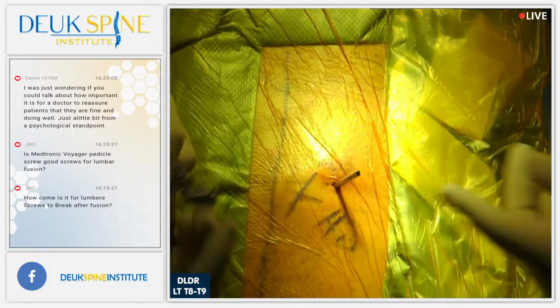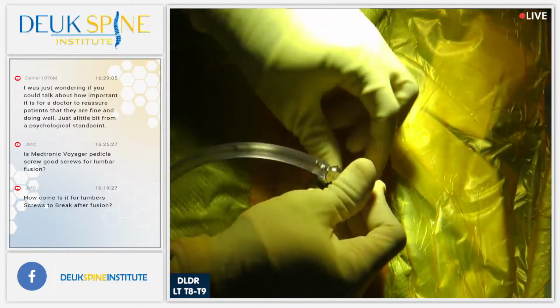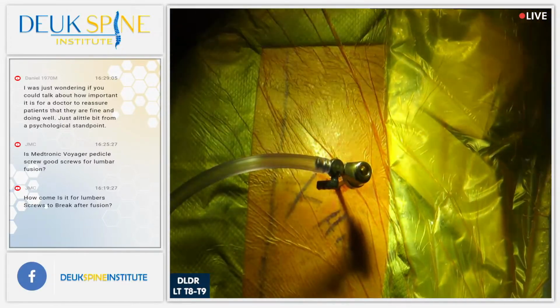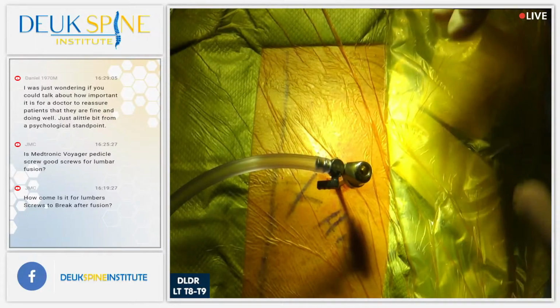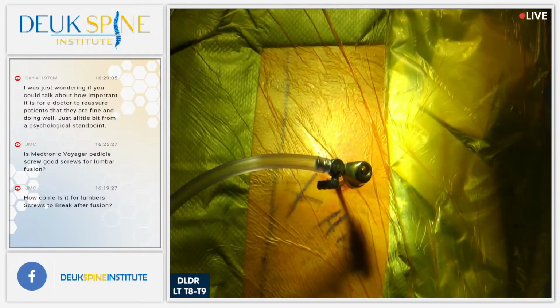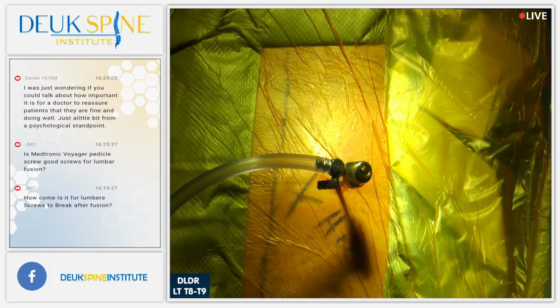By the way, we've lost 1 drop of blood. Here it is. Kind of splurted it around, but essentially 1 drop of blood. So this is bloodless surgery. There's no removing lamina or foraminotomy. There's no moving the heart over, taking ribs out, doing a costotransversectomy or a transpedicular approach. It's very safe.